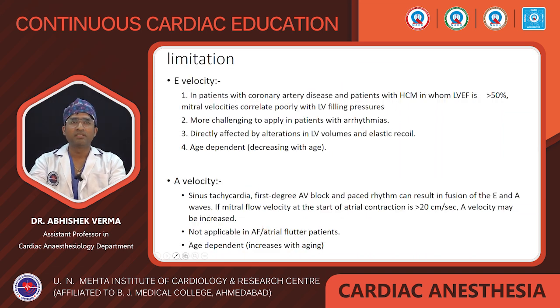And these are the limitations, same as what I told you already. It is a load dependent index. That is why it changes in coronary artery disease with poor LV filling pressure. It is also challenging in arrhythmias and is altered by LV volume and elastic recoil. It is also age dependent. It will decrease over the age because LV stiffness increases with age, after 40 you can say.